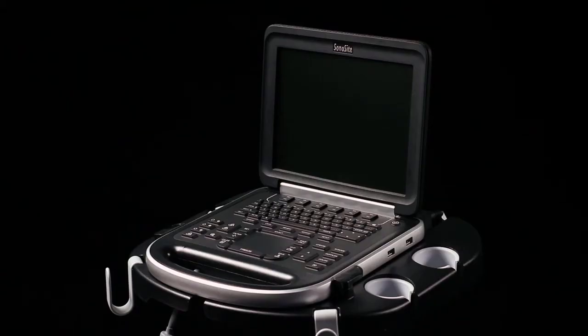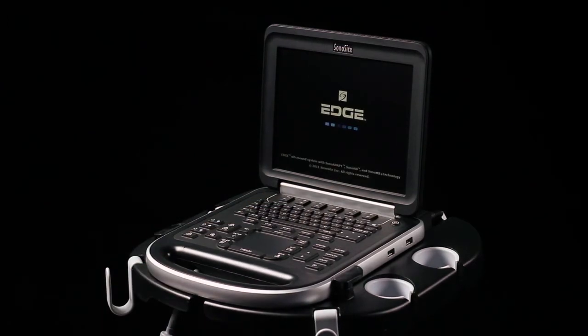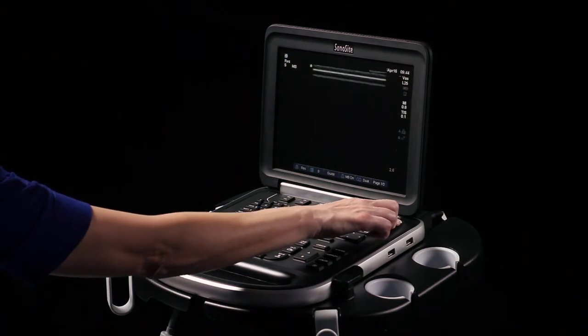To turn the system on, press the power key once. The system will power up completely in 15 seconds. Press again to turn it off.